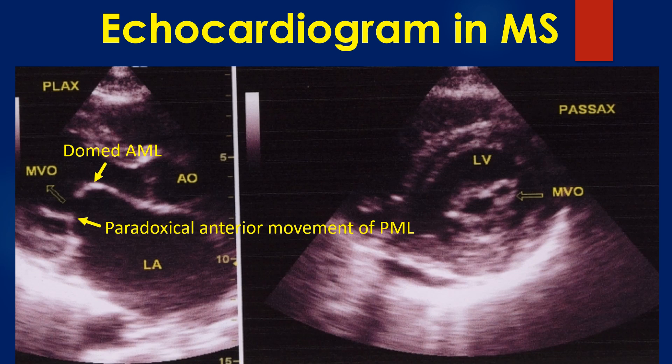The parasternal long axis view will give an assessment of the subvalvar apparatus. Subvalvar fusion may result in poor results after valvotomy as it can produce secondary obstruction beyond the valve. The parasternal short axis view is used for quantitating the severity of mitral stenosis by planimetry to measure the mitral valve orifice. Commissural fusion and calcification, if present, can be seen well on the parasternal short axis view.